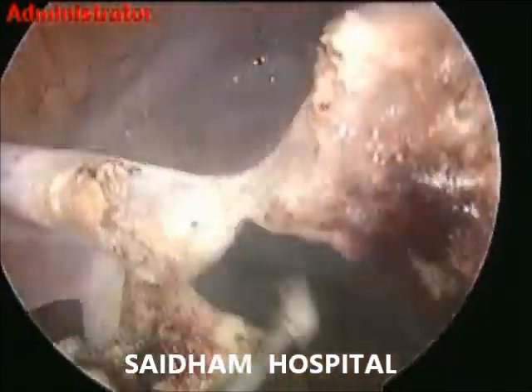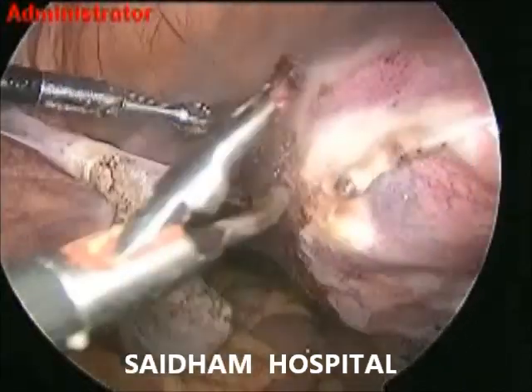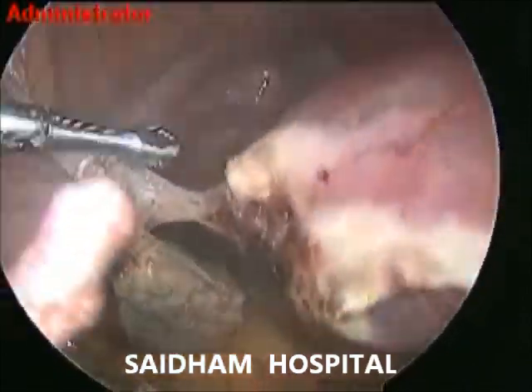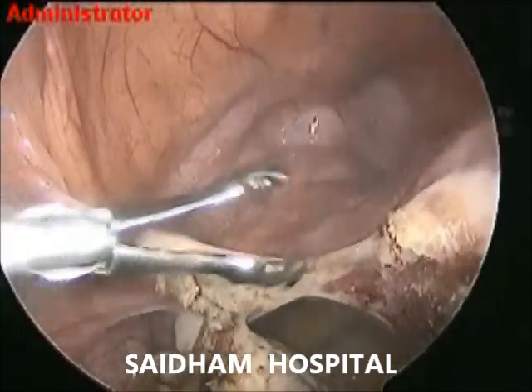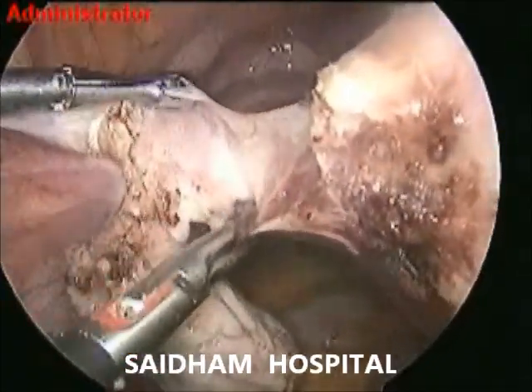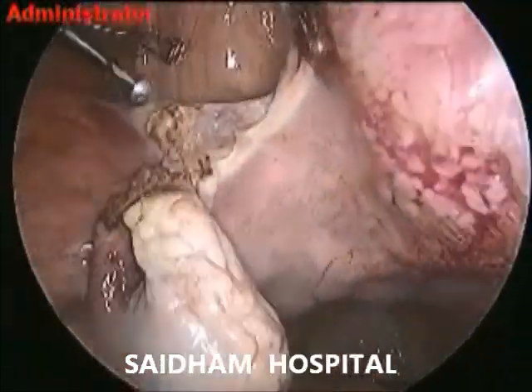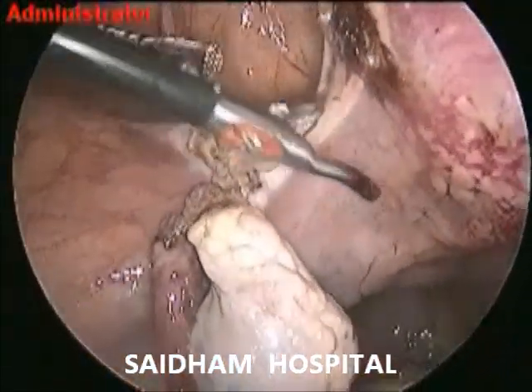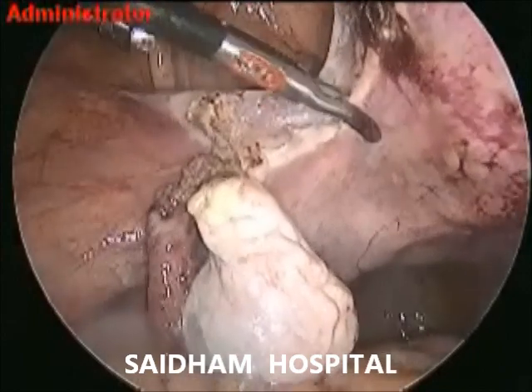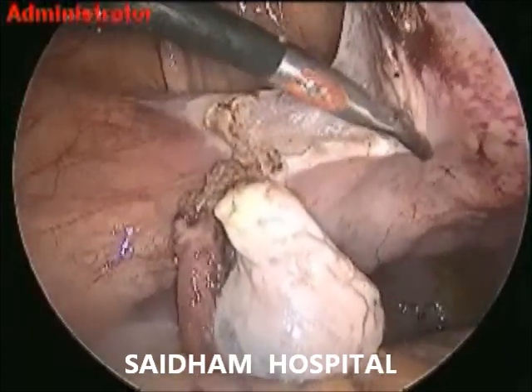Now I am getting the round ligament, now the broad ligament. Just separation of the two lips of the broad ligament is being done. Trace both lips of the broad ligament so that air will go in and there will be ease in the UV fold dissection. Instead of going anteriorly, because it is densely adhered and very vascular, I prefer to go posteriorly first.